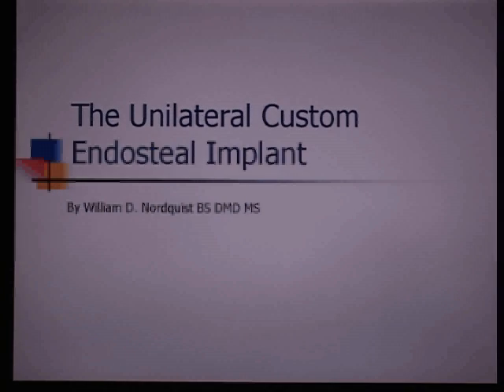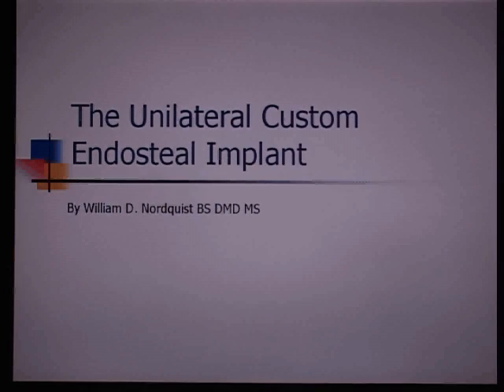The purpose of this presentation is to give you an idea what the unilateral custom Endosteal implant is used for. We'll go over in detail how to place various types of unilaterals and how to restore them as well.